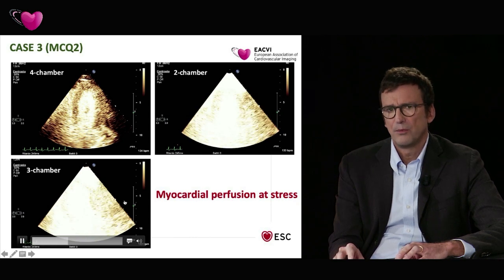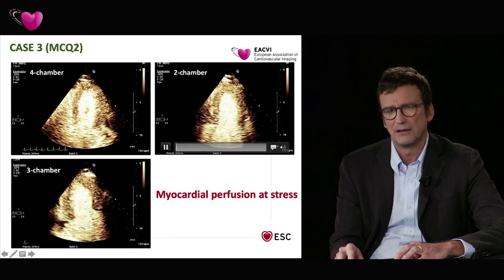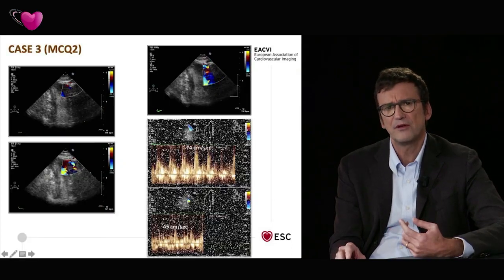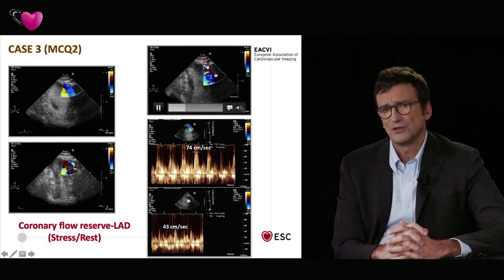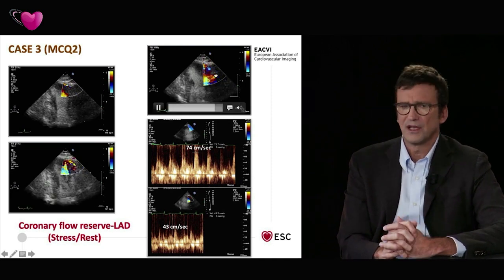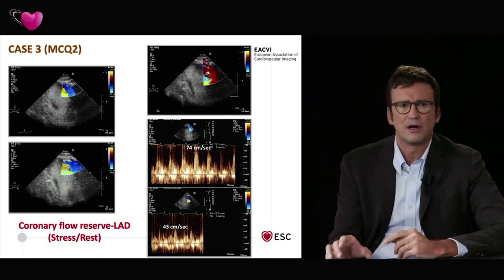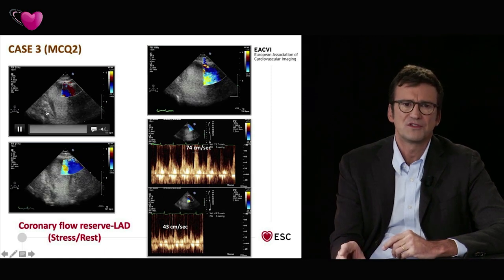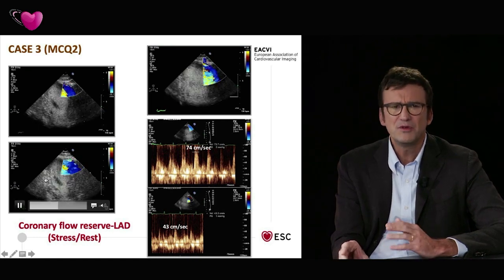Don't forget, 1.5 to 2 seconds for complete replenishment is allowed. But this is the third variable we were mentioning that is helped a lot by contrast. You can measure coronary flow reserve, obviously, without contrast, but contrast helps a lot. You see 2 or 3 chamber views. This is more of a 3-chamber probably. It's between the 2 and 3 chamber.